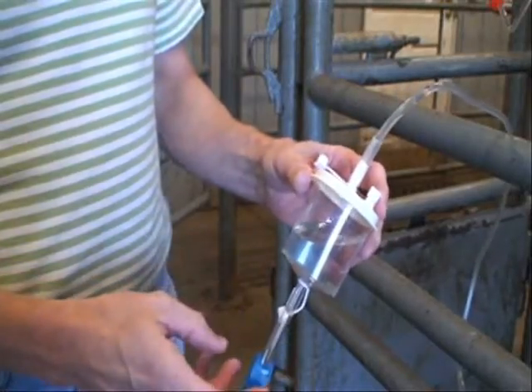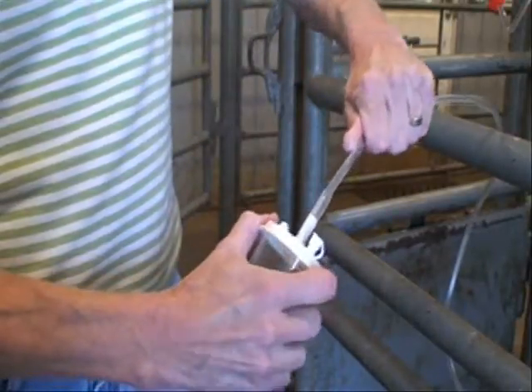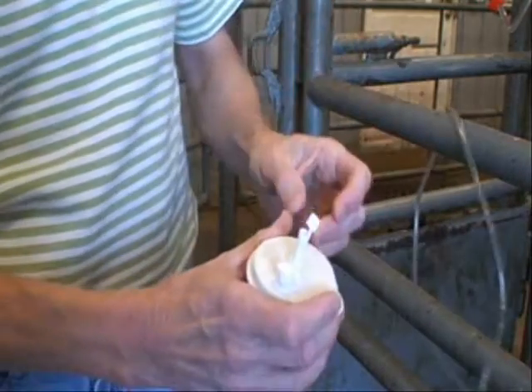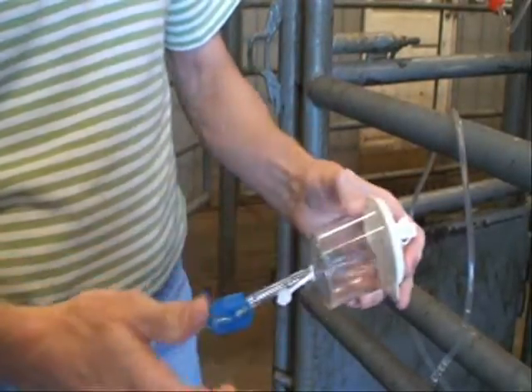When you're finished with the flush, here's how to remove the Y tubing. Don't grab and pull from far back — just grab closer right here with a nice firm grasp, then push and twist, just like this to disconnect. Disconnect and cap it closed.